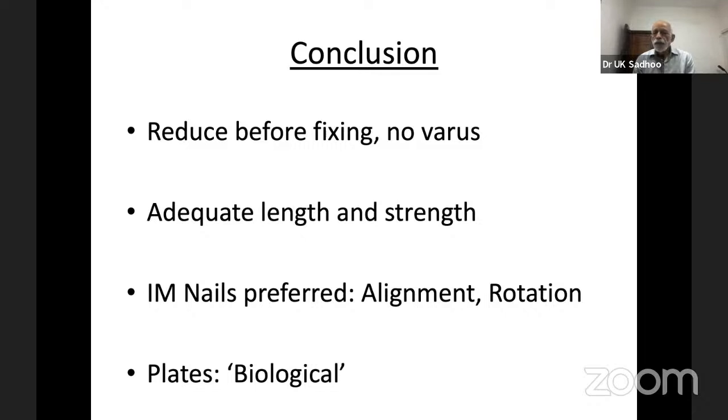And if you see radiologically, there's a tip of the trochanter visible. It's like a peak. You should stay at the peak, because invariably you will veer somewhat laterally, or the bulk of the nail will come out a little laterally. There is a peak of the trochanter which dips into the piriformis fossa. So stay at the peak.